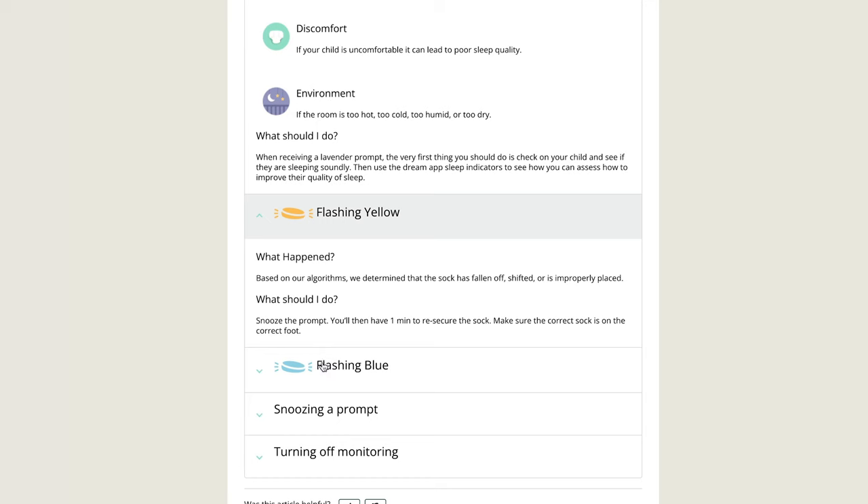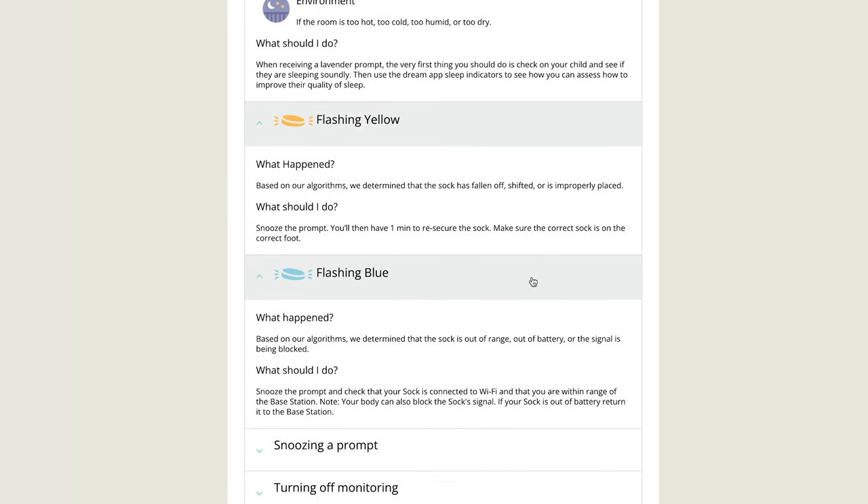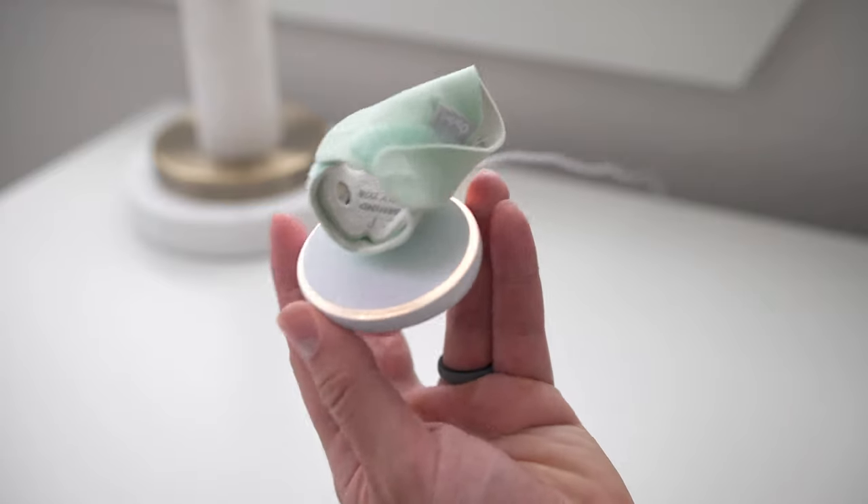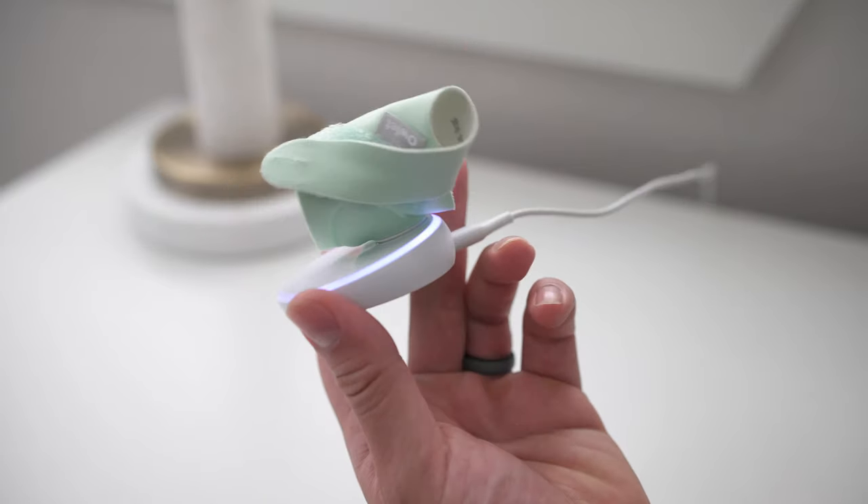Looking at the other base station alerts, we most commonly get the yellow alert, which means the sock kind of just came loose or something. Normally you just tap the base station, reset the sock, and it'll be good to go. But for whatever reason, we still keep getting these alerts no matter how many times I press the base station. What I have to do is put the sock on the charging pad for a beat and then pull it back off — that's a good reset. I don't know why that keeps happening, but that's just something we've noticed.